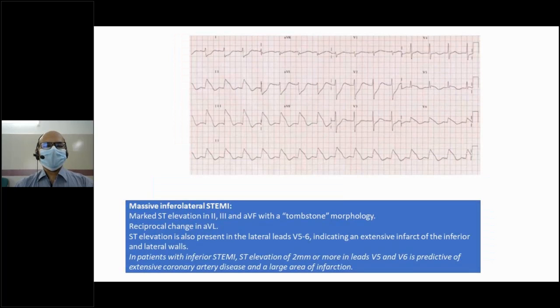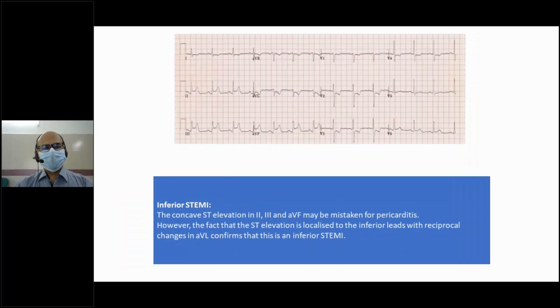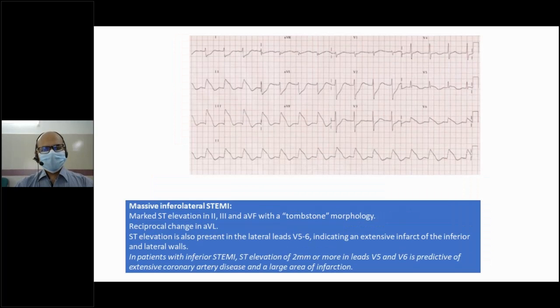This is another hyperacute ST segment elevation, massive ST segment elevation in 2, 3, aVF, and also reciprocal depression.